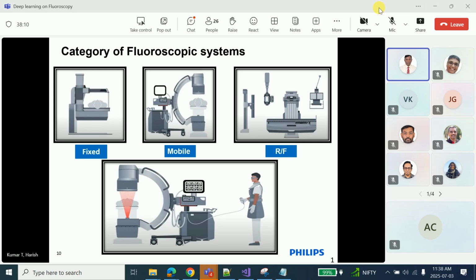It is used for intraoperative, corrective procedures, not diagnostic procedures. Whatever the other two systems are, they are diagnostic procedures. Before you do a corrective operation or any procedure, you need to find out what the pathology is, what has actually happened. Those systems help us find that out.